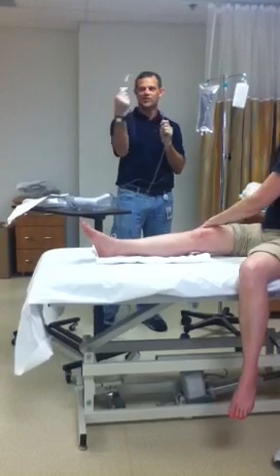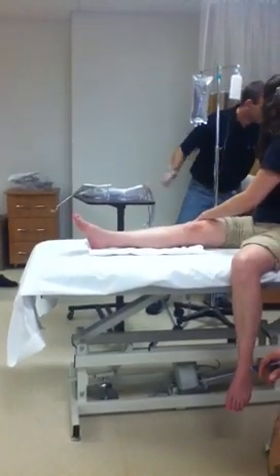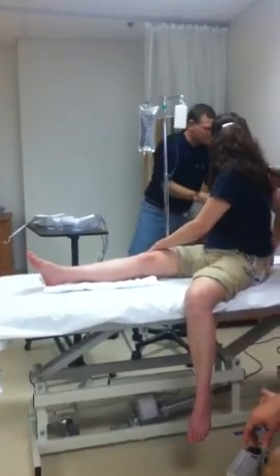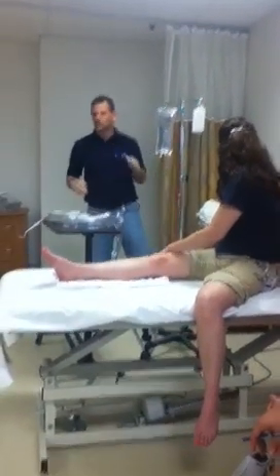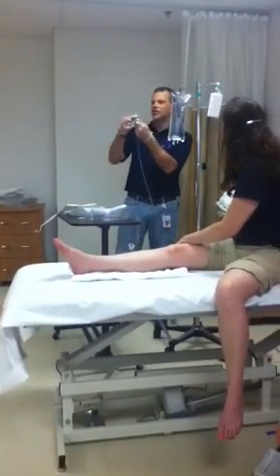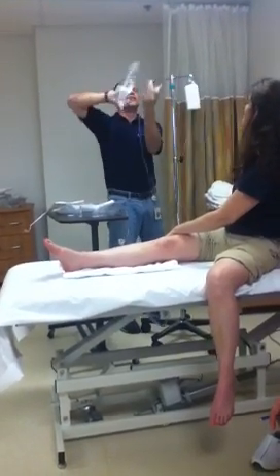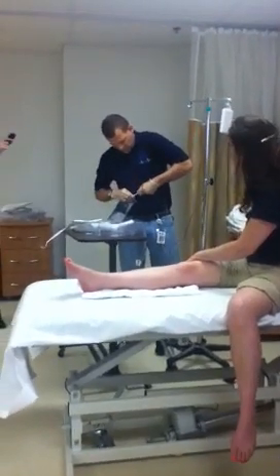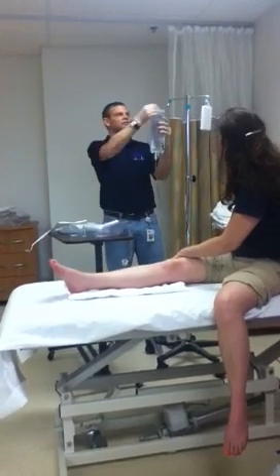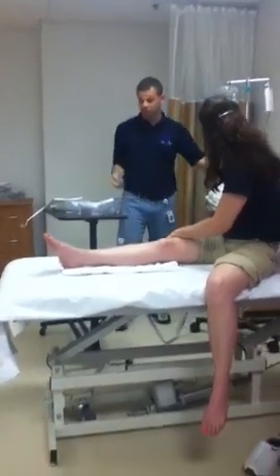The needle end is going to the saline bag. I need to support this because if I just start pushing the thing, I'm going to knock it off the wall. I still haven't touched my needle end, so my needle end is still sterile. I've got this little protective thing on there, and I'm going to flip this up and shove it right through there. Now I have a sterile needle into sterile saline.